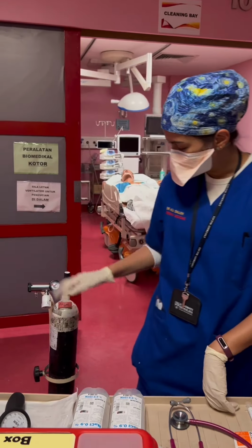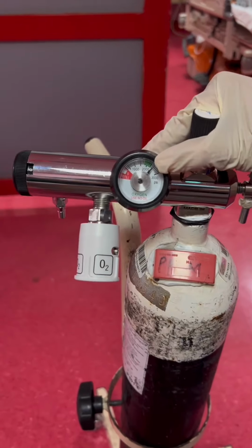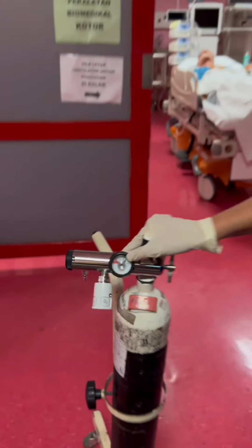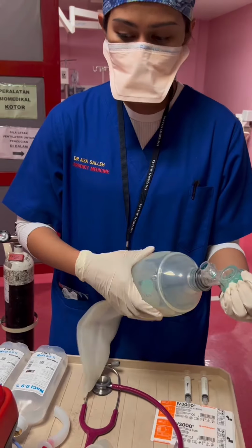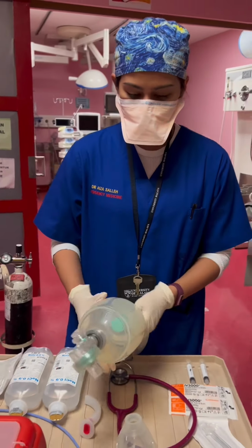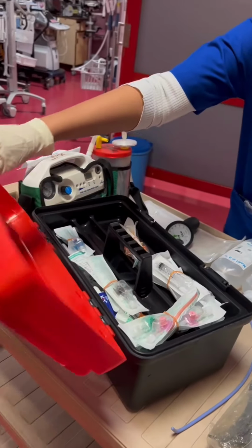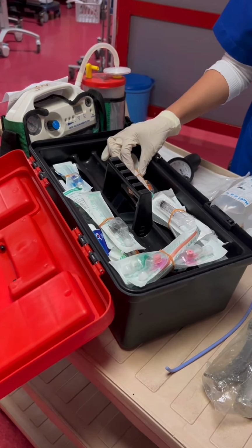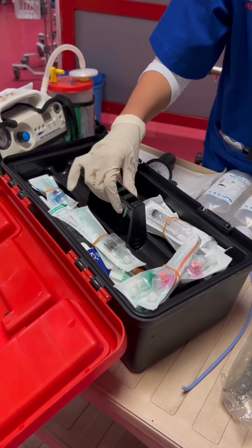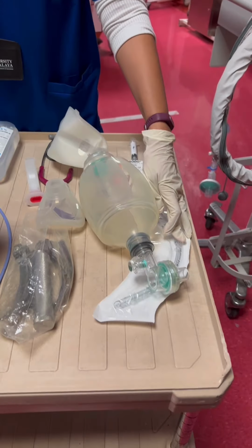We need to have an oxygen tank with the pressure gauge showing full oxygen, an HME filter, and a properly functioning bag valve mask, and we're going to transport all this equipment in our transportation box. In our transportation box, we also have our syringes, cannula, securing tube, OPA, and an extra endotracheal tube.